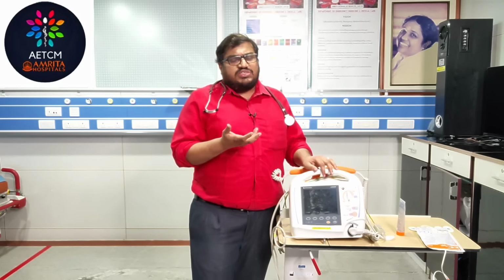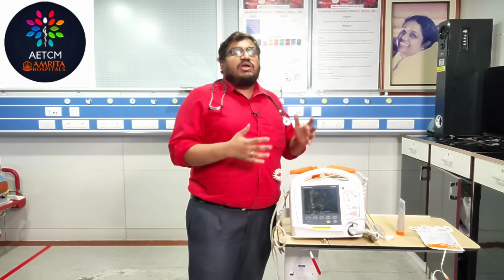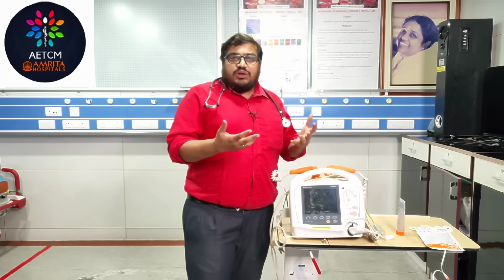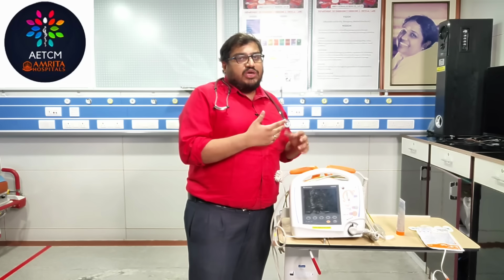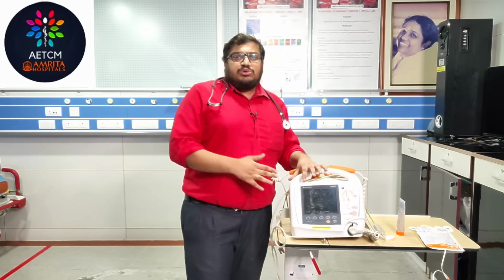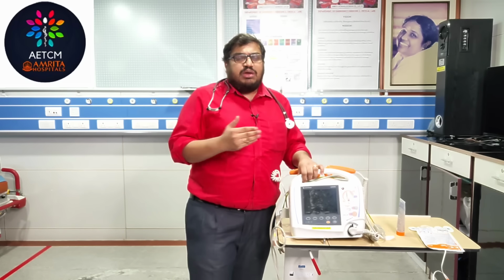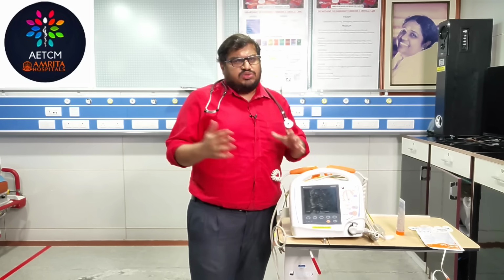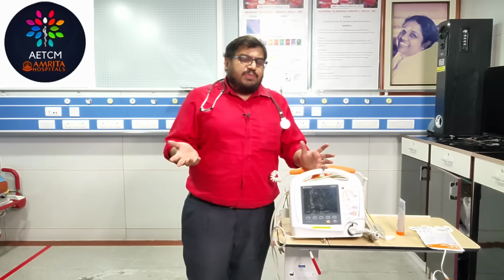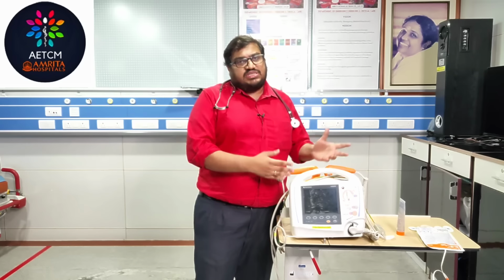When you think about a monophasic defibrillator, you need a higher amount of energy to be delivered, somewhere like 300, 360 joules. So the chance of trauma and electrical injury is more when you are using a monophasic defibrillator. But nowadays in the majority of places we see the biphasic defibrillator, where we don't need a higher amount of energy, maybe 200 joules, a maximum of 270 joules in some defibrillators. That all depends on the company, and there are a lot of companies. So that is the basic difference between a monophasic defibrillator and a biphasic defibrillator.